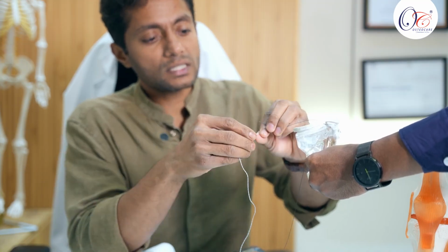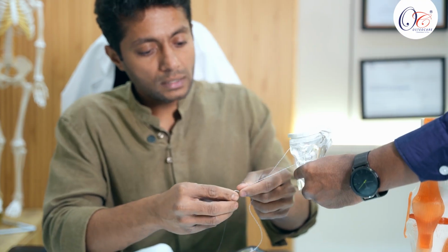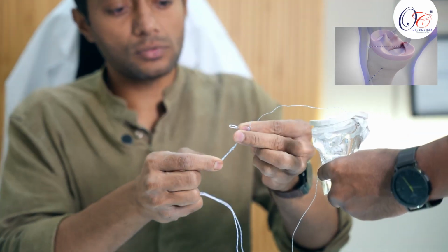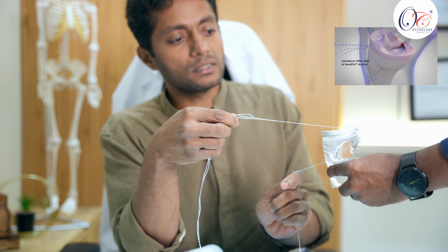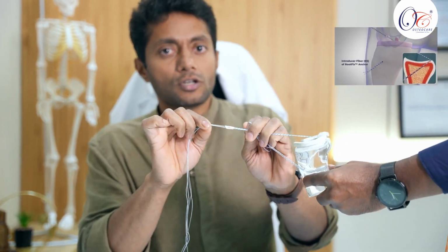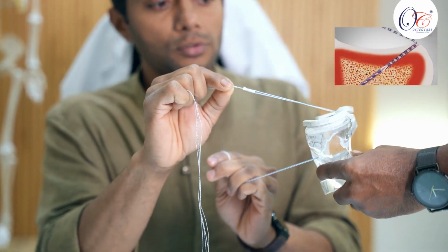So to avoid that, we started using this Loopin fiber where the straight end is looped and it is brought out from the tibial tunnel like this. So once this is here, now we have a fiber wire with a loop in the portal. Now we actually try to shuttle this suture through the Loopin fiber. So once we put these inside the Loopin fiber, we try to shuttle these through the tibial tunnel. So now we have this guiding wire, the soft tissue anchor and the suture threads attached to the anchor. So now retrogradely we pull the anchor into the tibial tunnel.